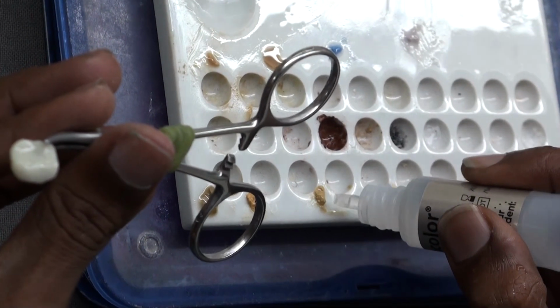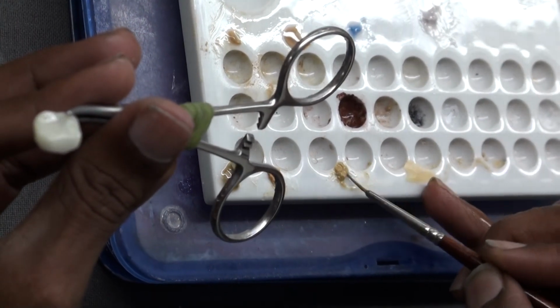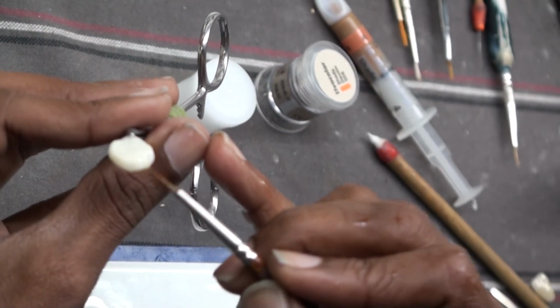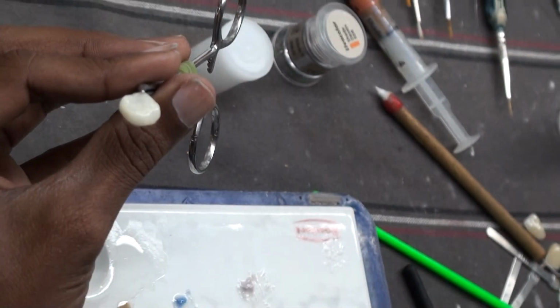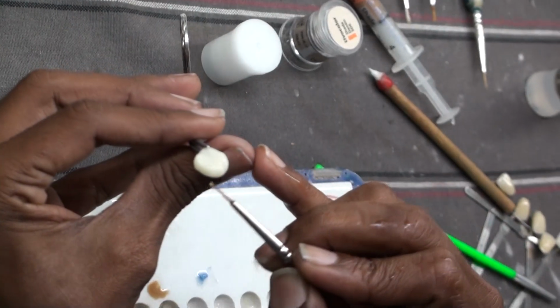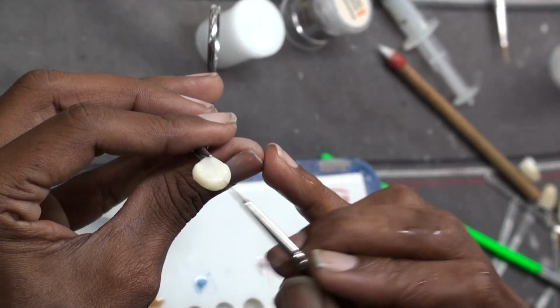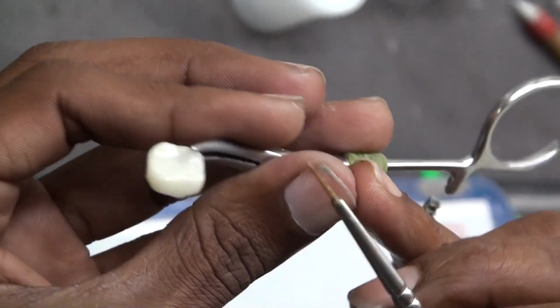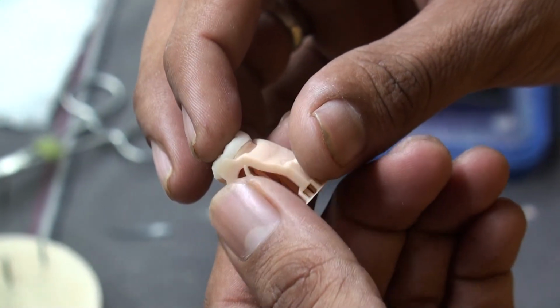And once you've done that, to give it some kind of a natural looking appearance, take a bit of stain and apply it to selected areas of the crown to give it that natural look. You can give it a very basic look depending on what the requirement is, and you can go full on with lots of occlusion stain and the rest of it. And there we go, that's the final fit of the crown. I actually should have shown a plaster model, but I'm just showing you a printed model.